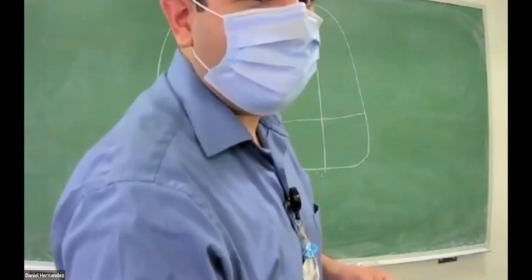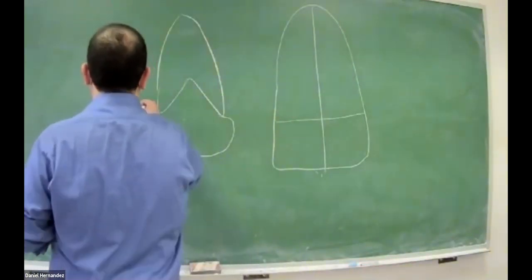In the blue workbook, they have the wall segments in there, page 1. Yep. You guys wanted to use that. So inferior, anterior.